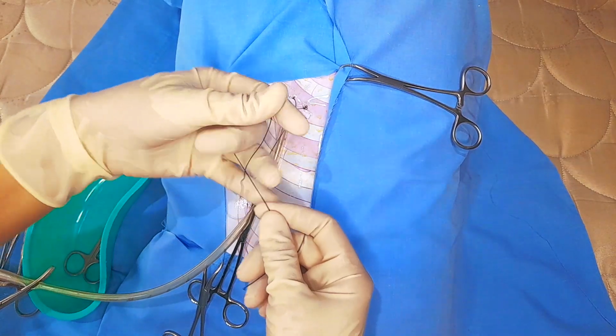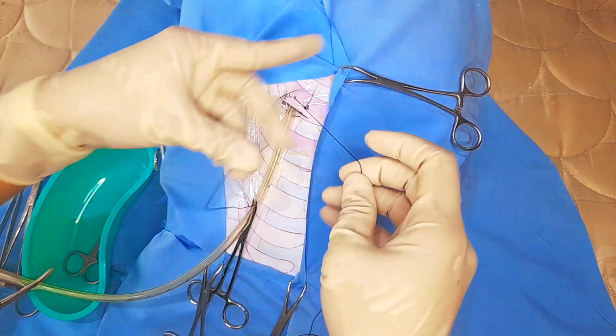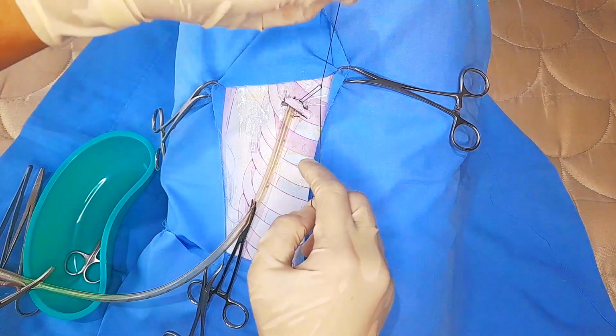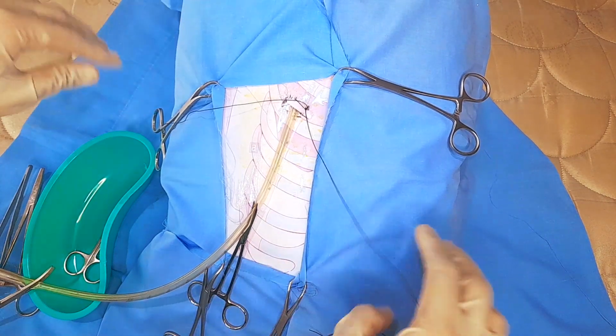Cut the needle and tie the two ends of the thread with a square knot. Make a series of X's around the tube. Pull the loops proximally and secure with another square knot.